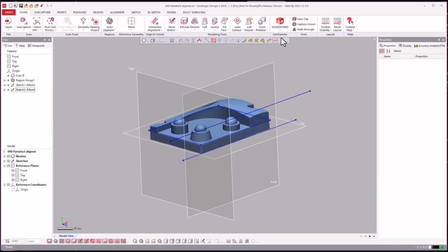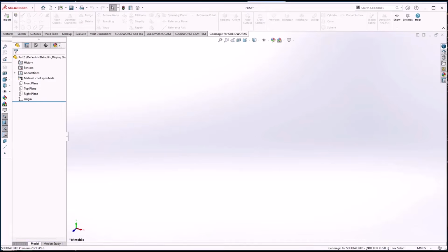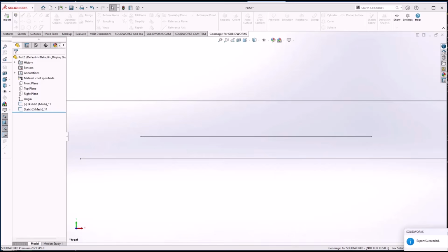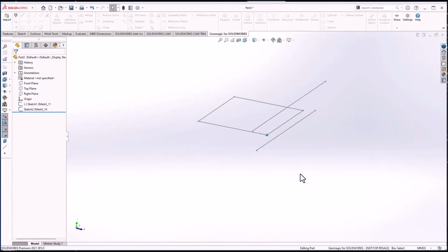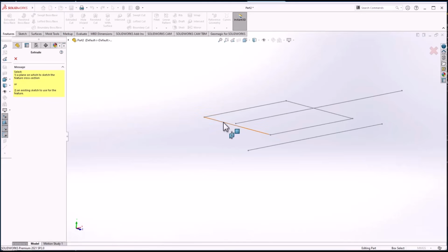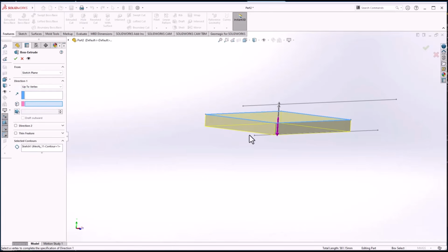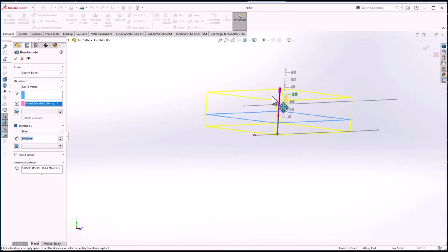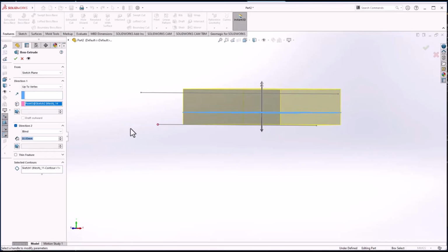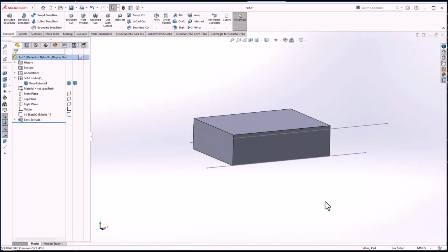And then I just come over and say, I want to live transfer that to SolidWorks, start from first feature. And I'm just going to hit it and then toggle over to SolidWorks. So you see that? And I can just say, hey, I want to extrude it. So the workflow I'm showing here is, let's just say that I have something that I want to model, and I can say up to vertex. So I just want to extrude it in that direction up to that vertex. And then the other line I just used as a reference to extrude farther, and then hit OK. So now you see that I extruded that.